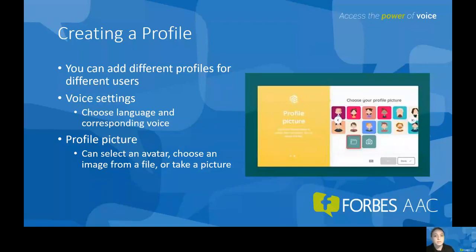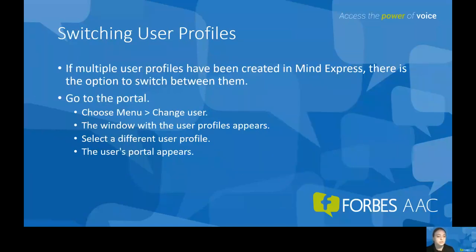There are several starting page sets to choose from, including symbol communication, text communication, games and music, as well as educational options and different accessible apps. If you have several users, it's super easy to switch profiles. If multiple user profiles have been created, you can switch back and forth by going to the menu and clicking 'change user.' All user profiles will appear and you can select the one you want.